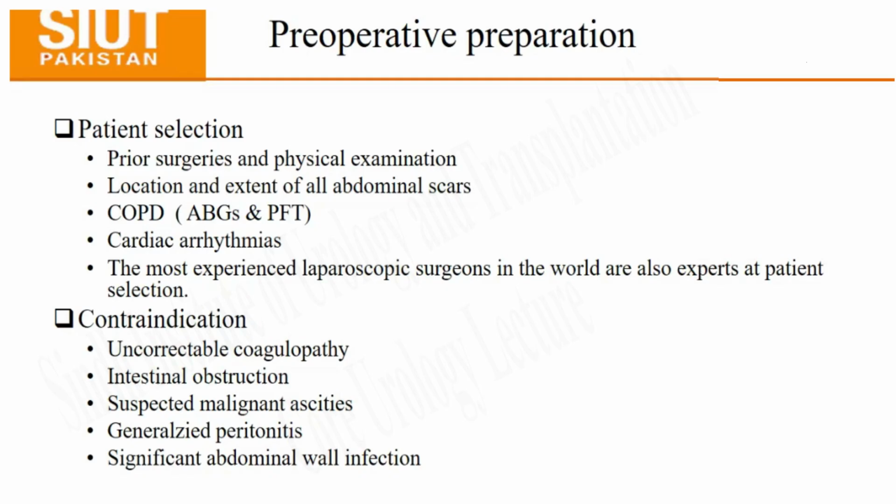In open surgery, when we cut a tissue, we can feel with fingers, is there any vessel? But in robotic, we do not feel. That's one of the points. What else?